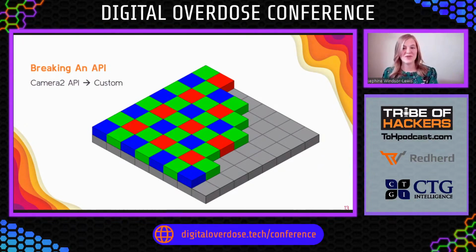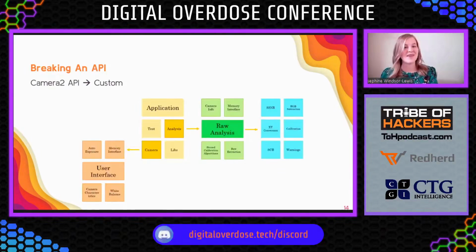It's quite tricky. So we built a custom module to convert from raw sensor image data to a TIFF. That's a tagged image file format, a TIFF6 specifically, which is a standardized raw image format. Currently, this is only hard-coded for a couple of phone models, the Samsung S8 and the Nexus. But in future production, we hope that this can be widened to a whole range of different phones.